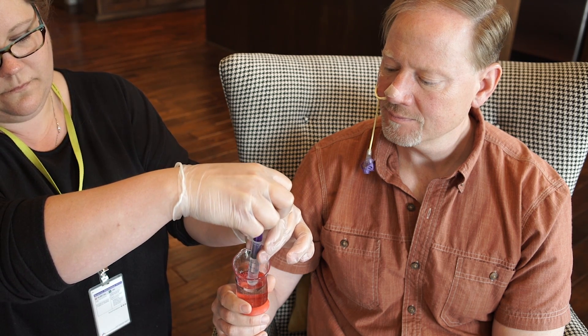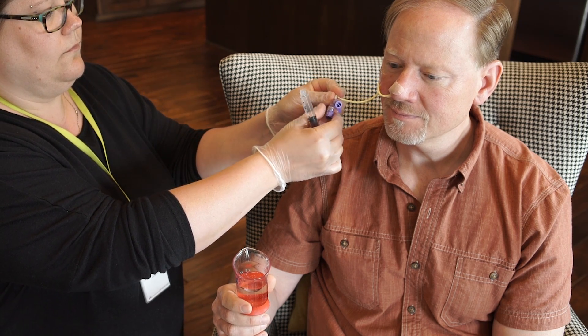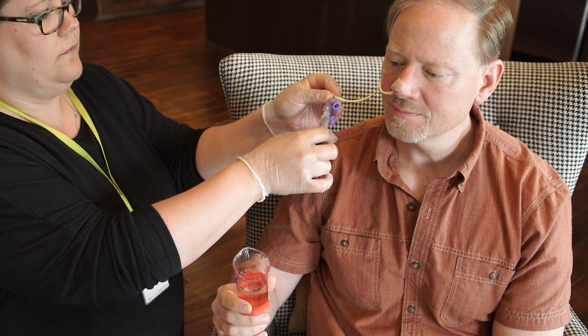Flush the tube with the prescribed amount of water. You may now begin using the feeding tube to deliver liquid food, water, or liquid medicine.